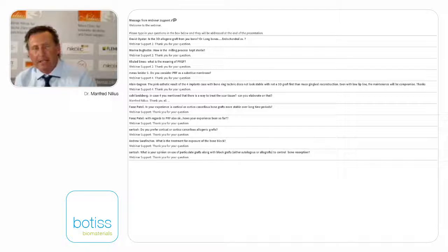So we decided to have a normal gingival rim. So that was our indication for immediate implantation. And the patient asked for having the implants as fast as possible because she's a VIP here and she is dealing with a lot of people.